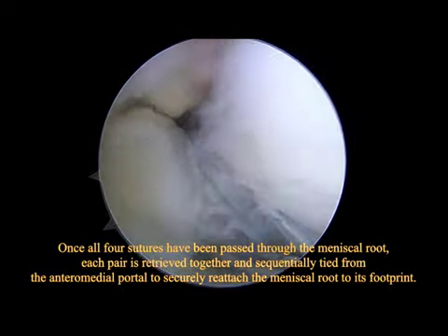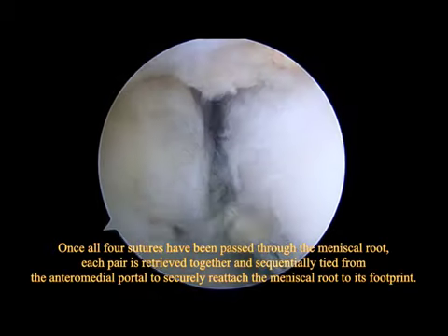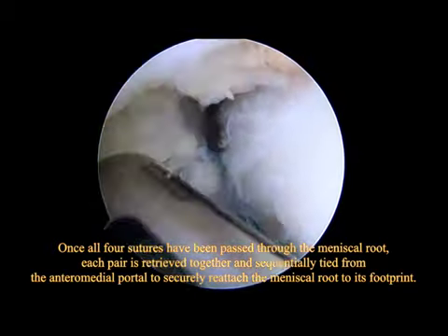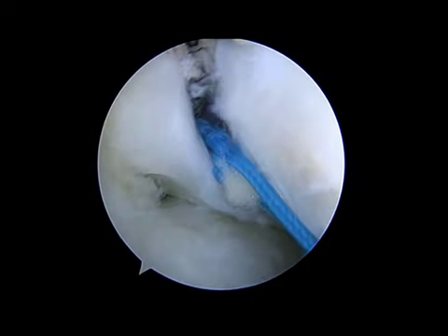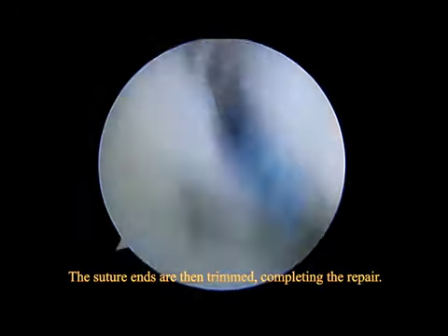Once all 4 sutures have been passed through the meniscal root, each pair is retrieved together and sequentially tied from the anteromedial portal to securely reattach the meniscal root to its footprint. The suture ends are then trimmed, completing the repair.